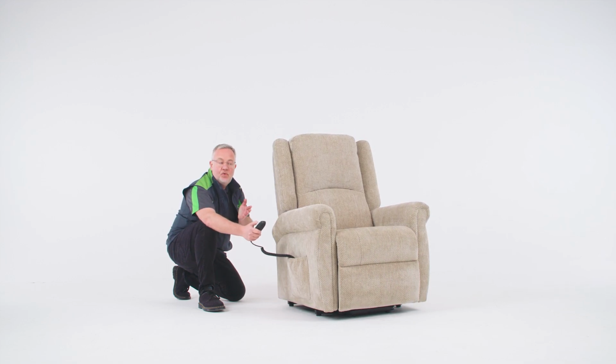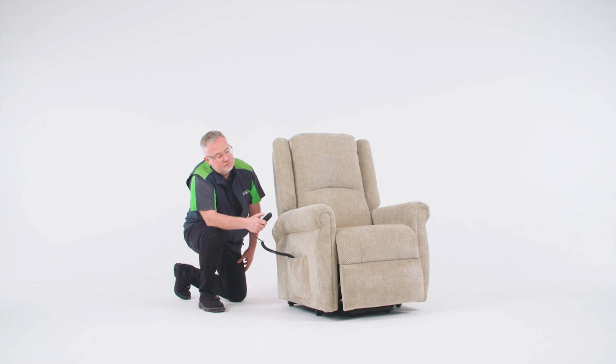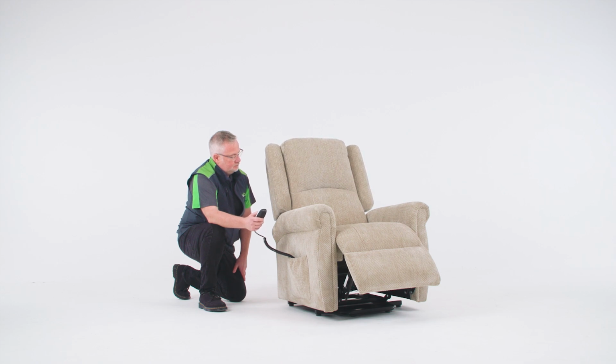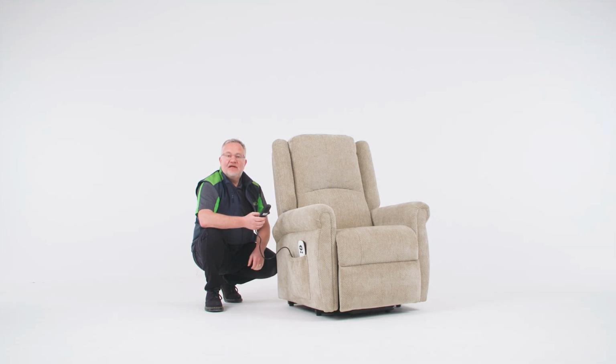And once down, we can just check the leg rest, and also we can check the backrest. With the mechanicals of the chair now checked, we'll just check the heat and massage function.